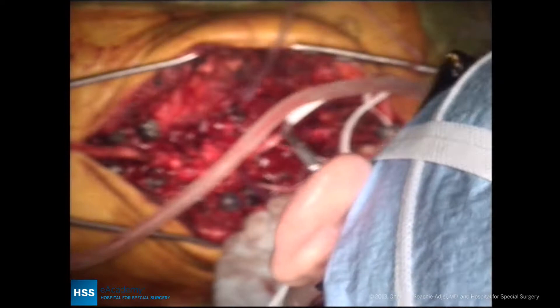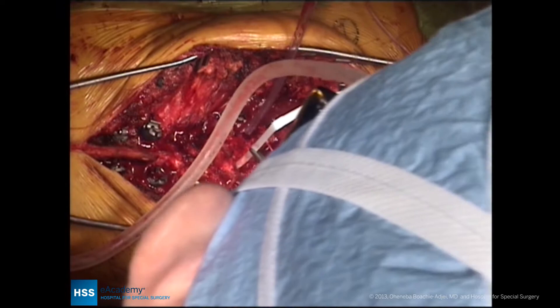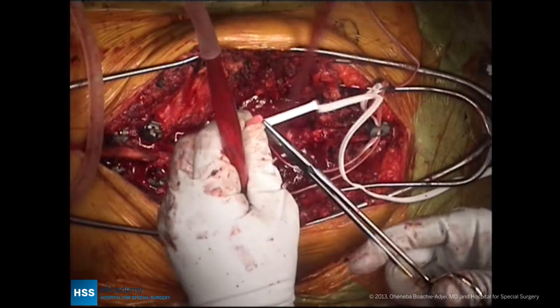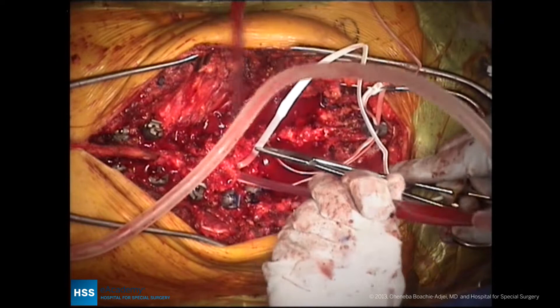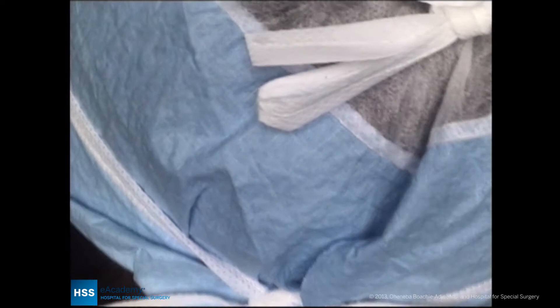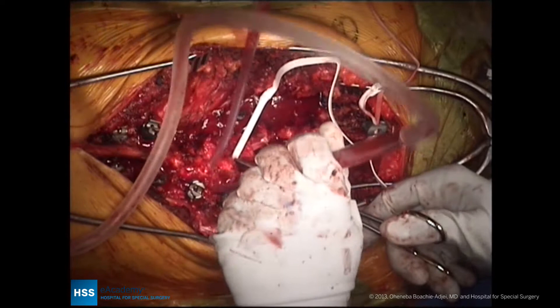The universal clamps are passed just like we would pass sub-laminar wires. A ligamentum flavum excision is performed by doing the ponte osteotomies. Universal clamps are curved to the width of the lamina, and then passed from inferior to superior using a needle holder. The universal clamp is a pretty safe flat tape, which hooks the under-surface of the lamina, and it's safe to prevent injury to the dura itself.